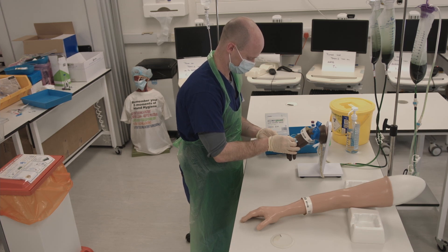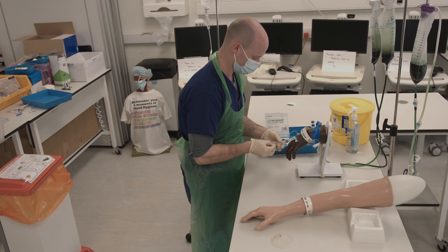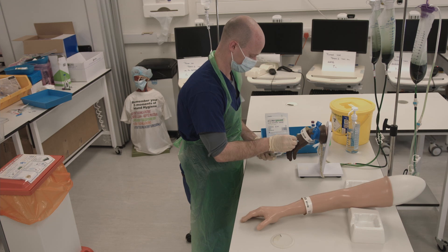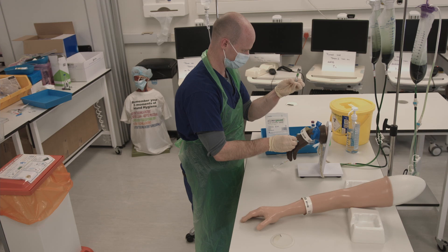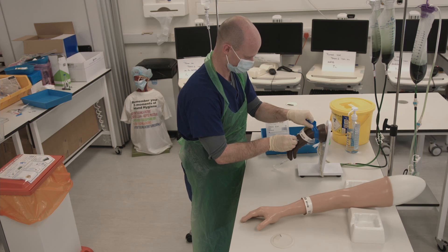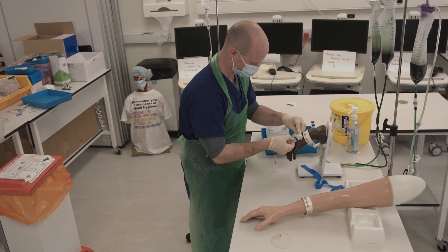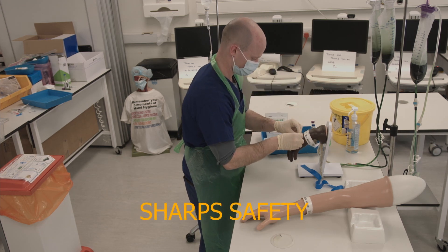Depress the plunger of the VBG to expel any air, and release the tourniquet. Remove and retract the needle, immediately covering the puncture site with gauze, and dispose of the sharp in the sharps waste bin. Tape down the gauze.